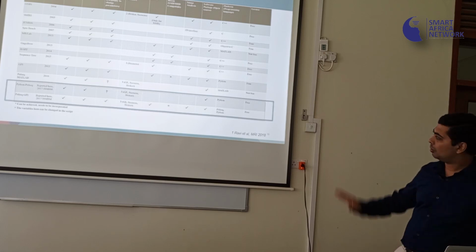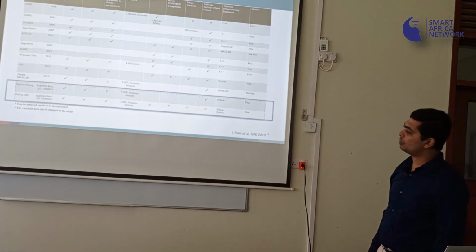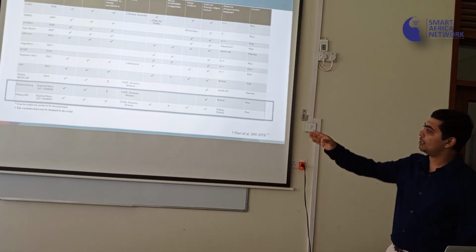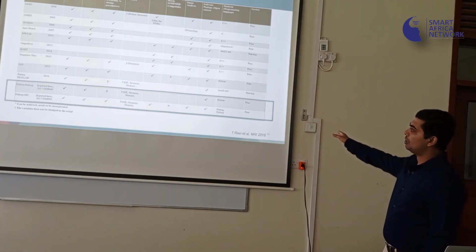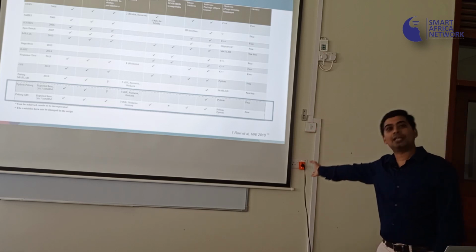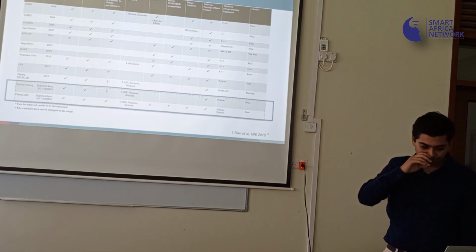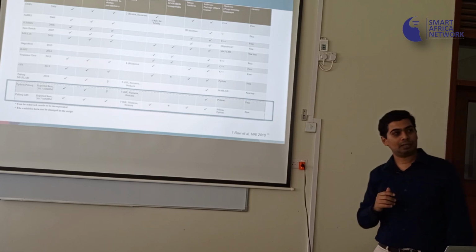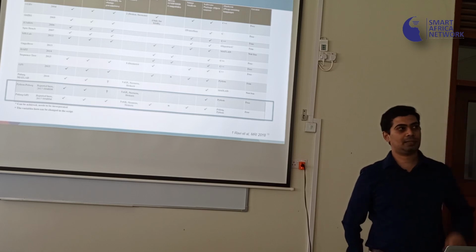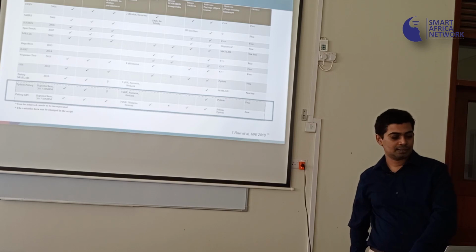So we've added 2 more to that already existing huge number of tools. The good thing though is as you go from left to right, you can see the bottom one actually checks off many things that you want to do with an MR scanner compared to the rest. So that's been the contribution. If you wanted to pick one tool, for example, for machine learning, today probably the most unanimous choice would be TensorFlow. So this is similar to that if you wanted to develop things for your scanner.